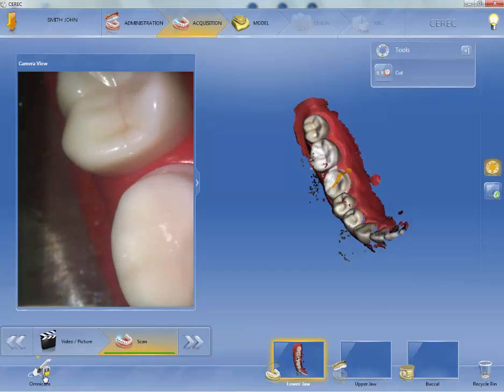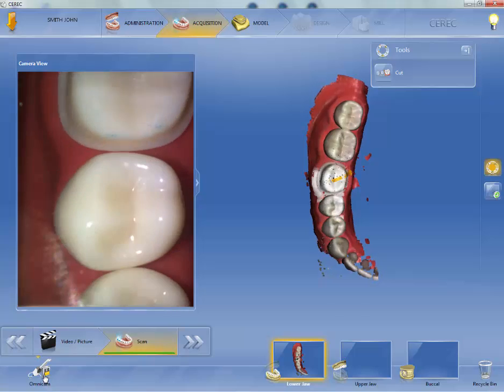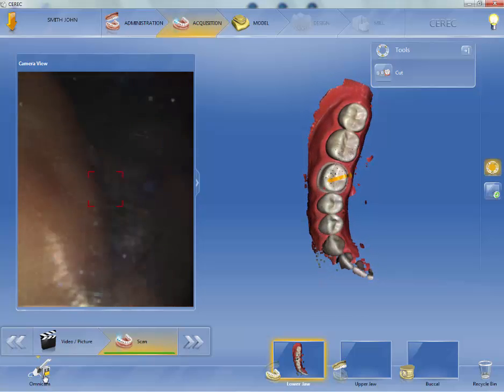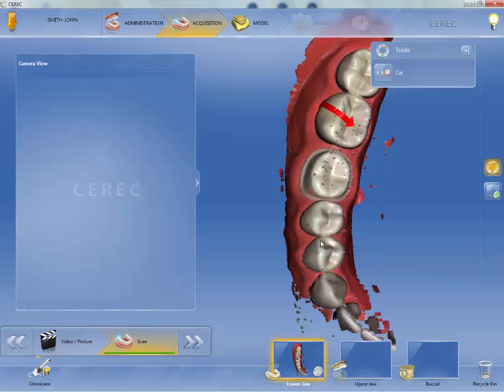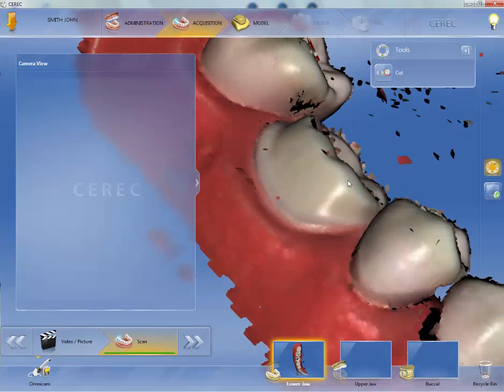And when you're doing this, you can either watch the screen, or you can watch in the mouth and see where you are and just listen for the music. And if you see, I can roll this up. Again, this is all scatter, so I'm going to throw that away.